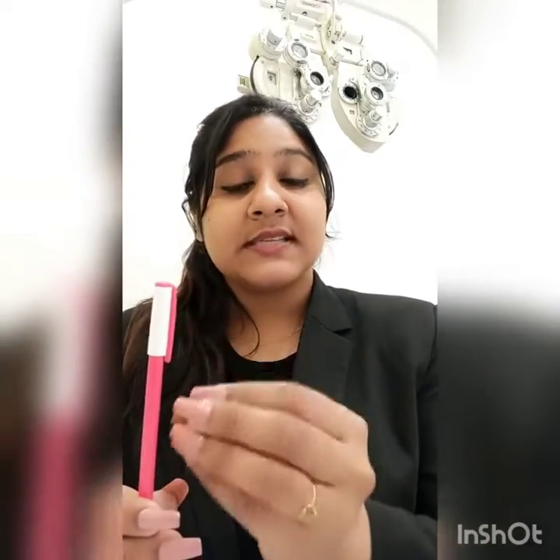So I will demonstrate that also. I have this pen available now. It's a normal pen, but please remember that this pen has symbols of different colors and different shapes. Why? Because this is the main important role of the symbolization. We can move this pen or pencil, and the accommodative stimulus for the eye, with the variety of colors and shapes, is easier to catch. Otherwise, the accommodative stimulation will be lesser than normal.